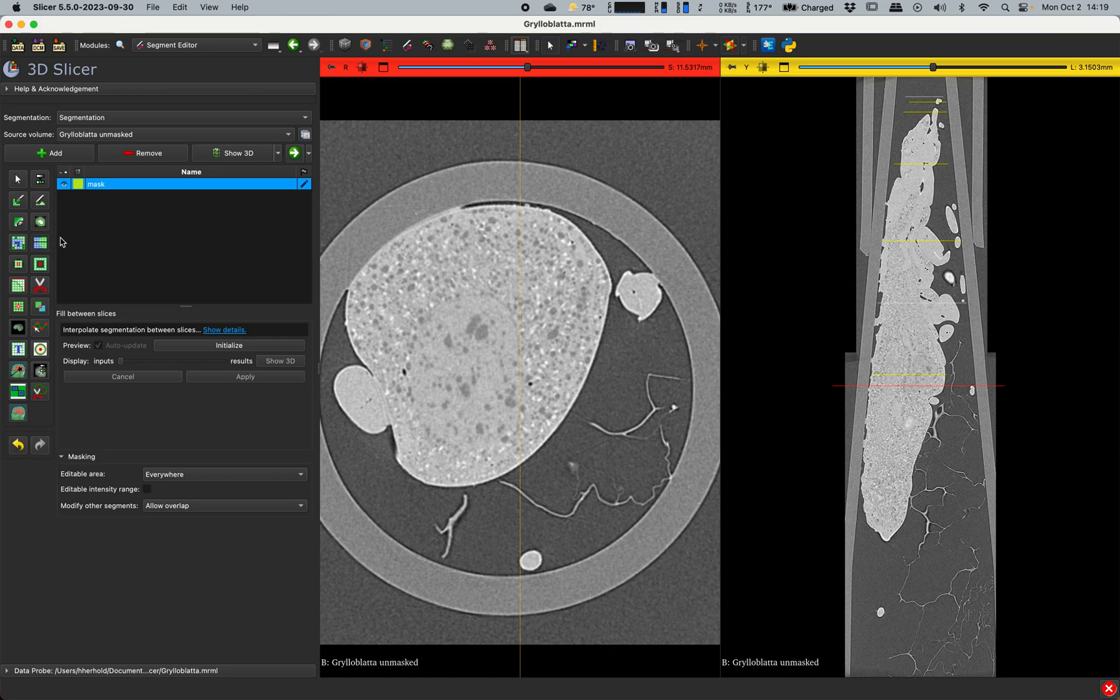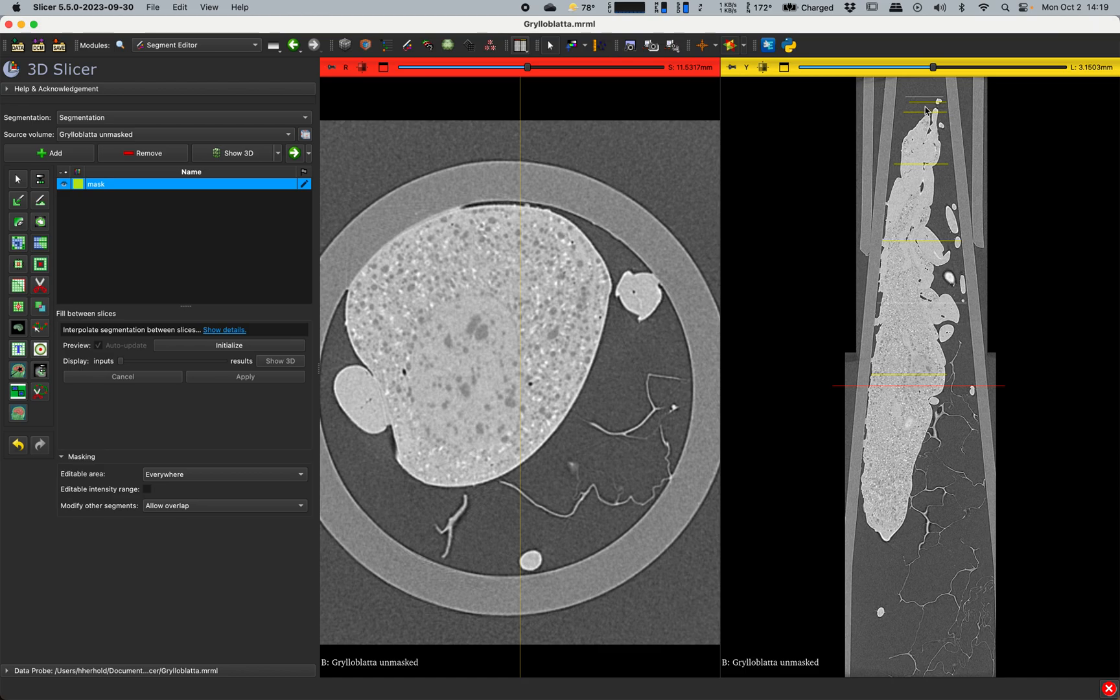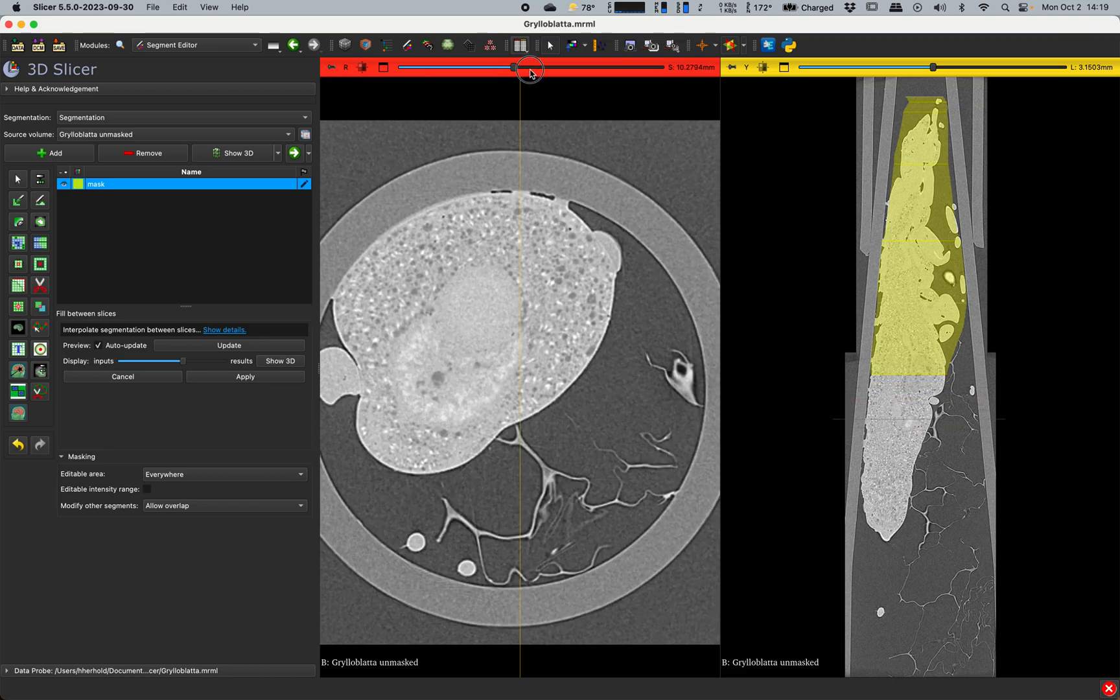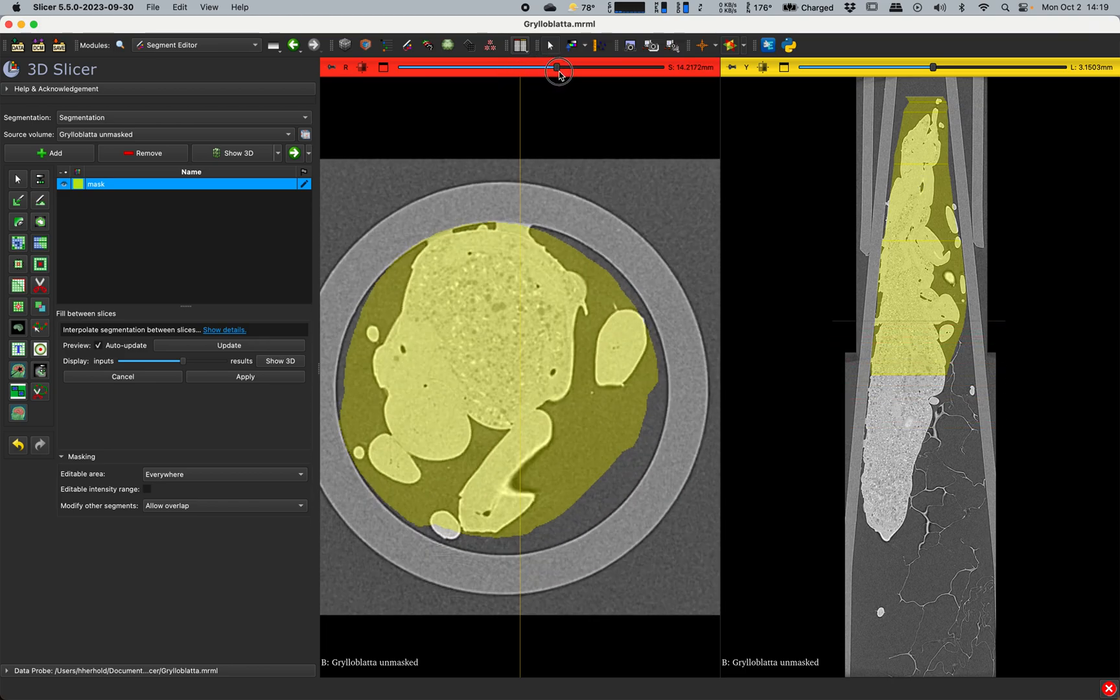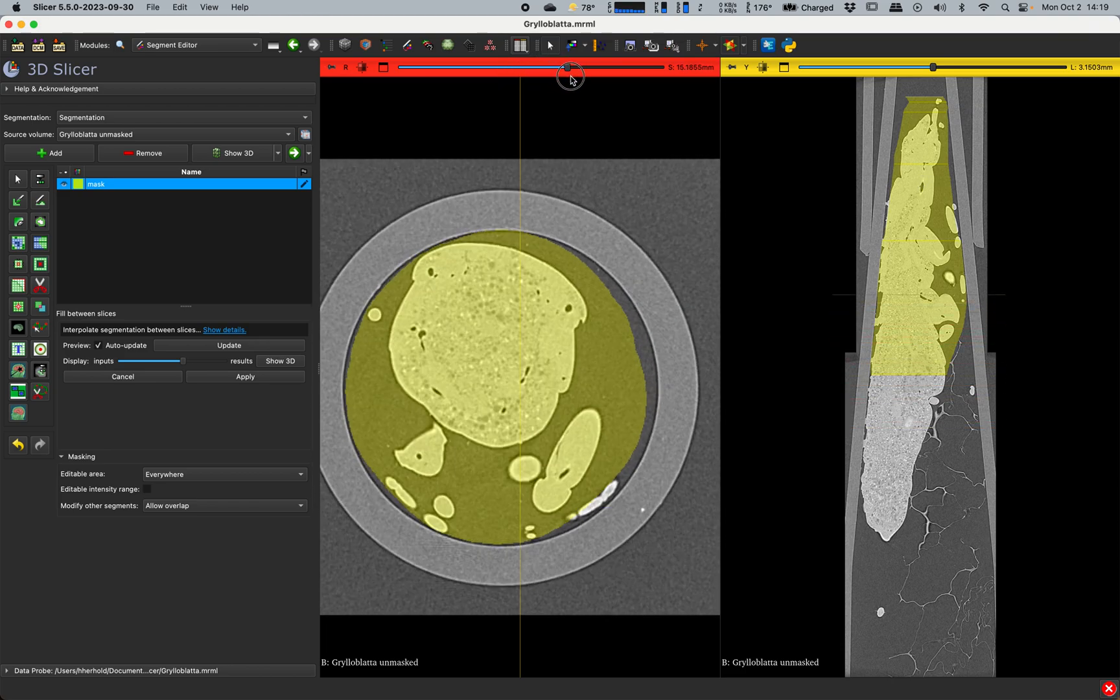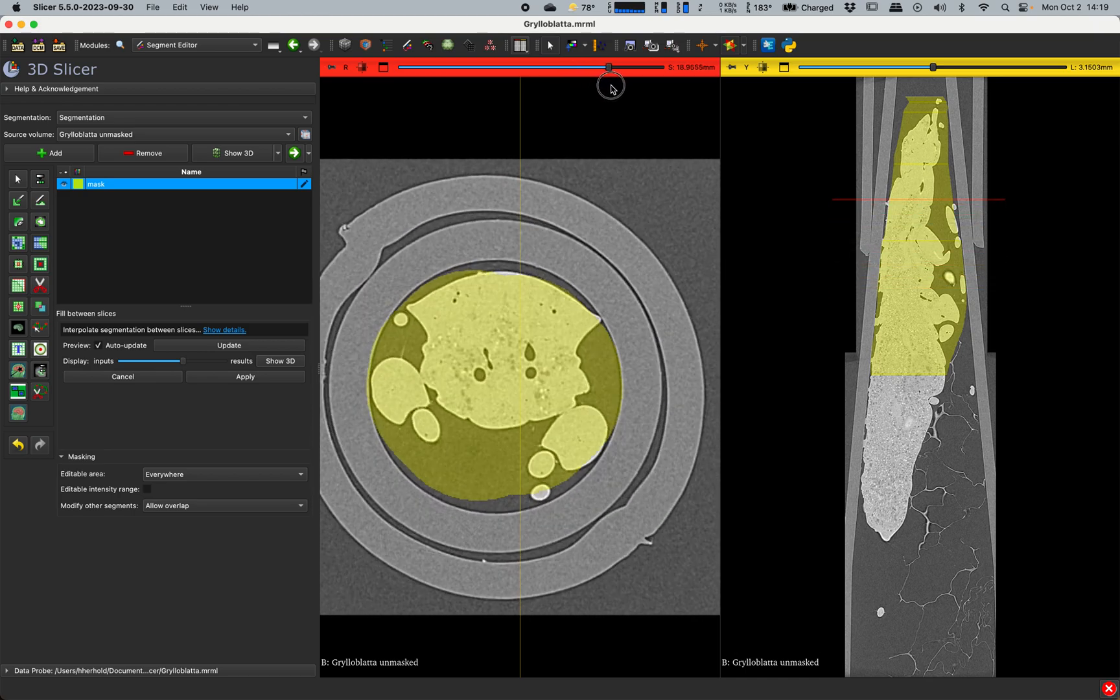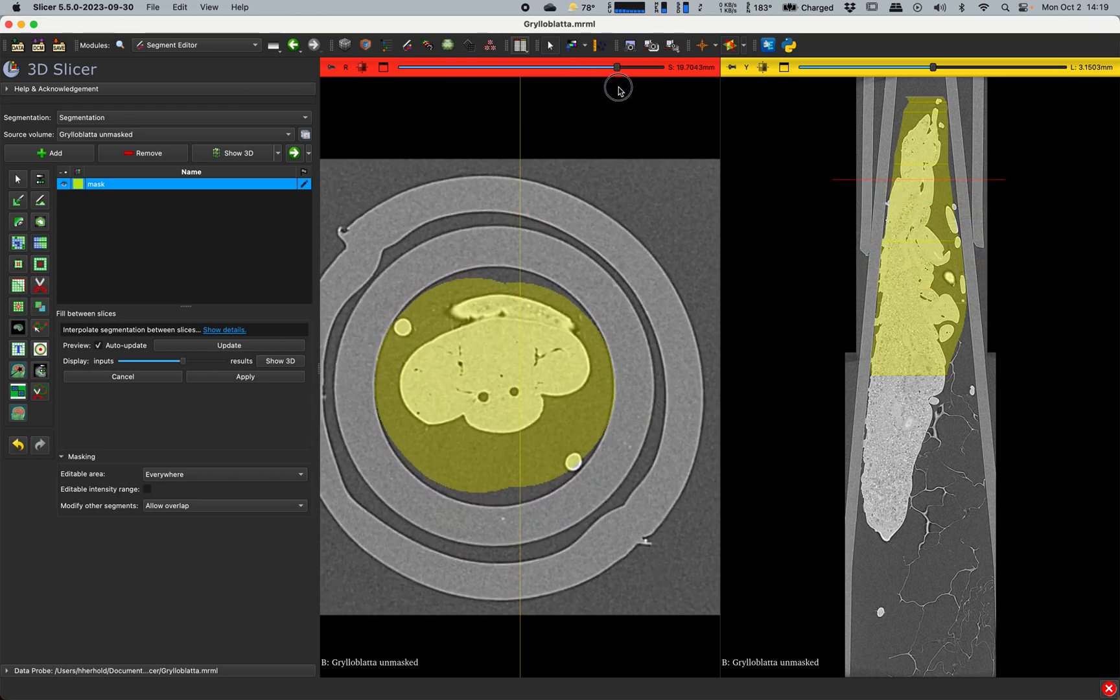So now if I scroll through the entire volume here, you can see that there's a number of spots where I've painted sort of a disk that incorporates everything in that slice that I want to be in my final good volume. If I were to continue doing this, I would go all the way down here and include the legs and stuff like that. Now what I will do is go over to fill between slices. What this will do is it does an interpolation down the length of the volume, depending on where you put the slices, and it will fill in between these.